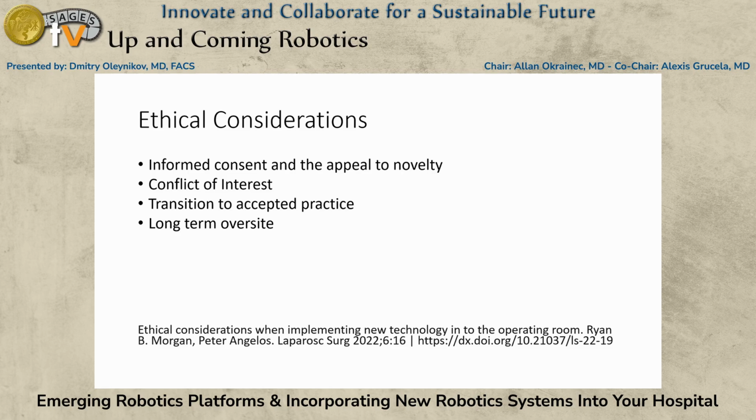Transition to acceptance in practice. If it's the first case in the world, there's going to be very, very little acceptance because nobody knows what's going to happen. If it's the 1,000th case, that changes the discussion.